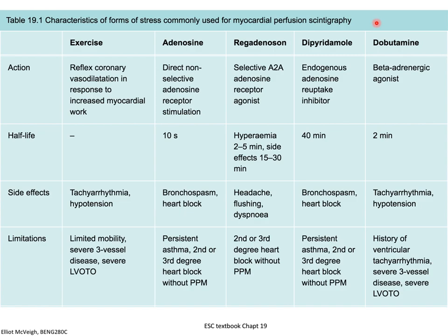Okay? But there are many, many forms of stress tests performed in cardiology. Exercise is that one on the treadmill or a bicycle. Sometimes you have the patient sit on a bicycle and ride the bike. Sometimes they're recumbent in the scanner and you have pedals at their feet and they can pedal while they're lying down. Those have been designed.